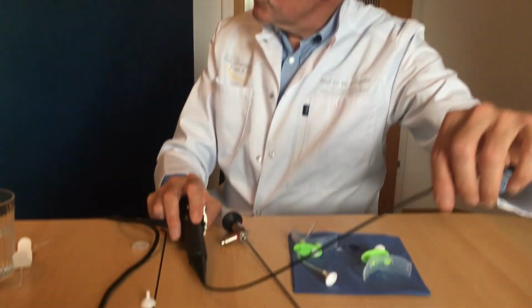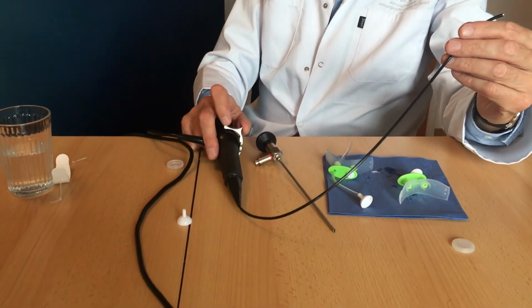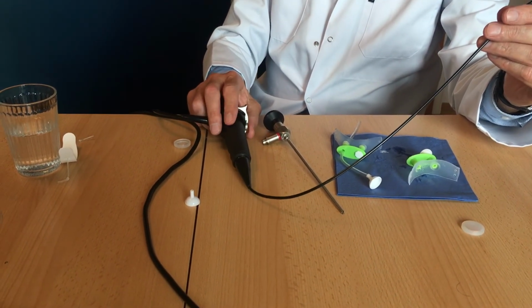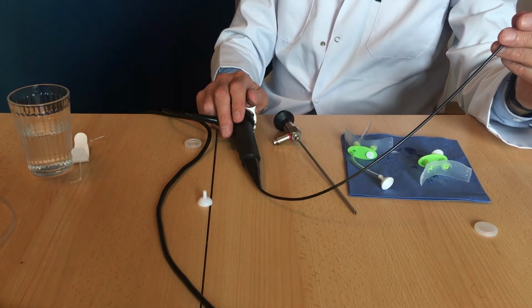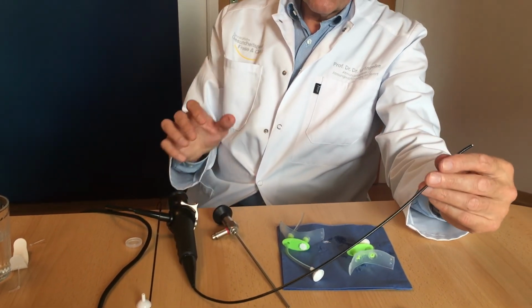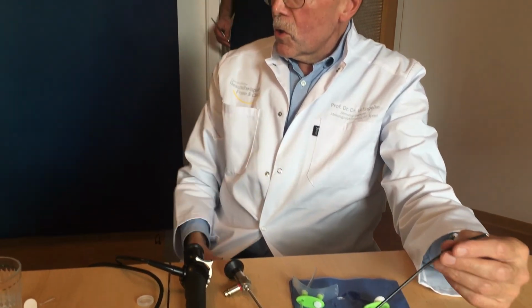Okay, we will repeat this exercise with an endoscope. With the camera connected. This can be done with two examiners even better.